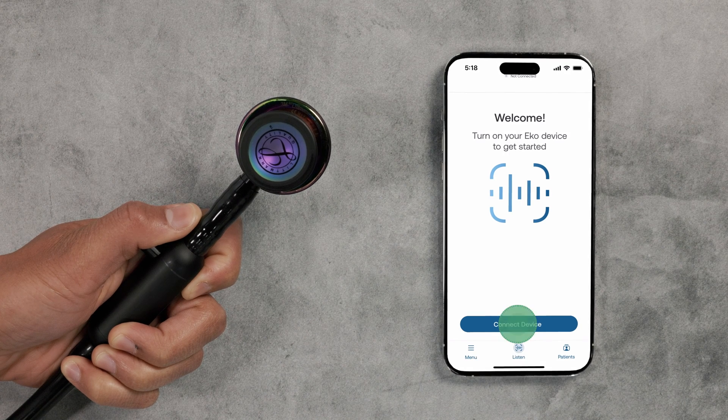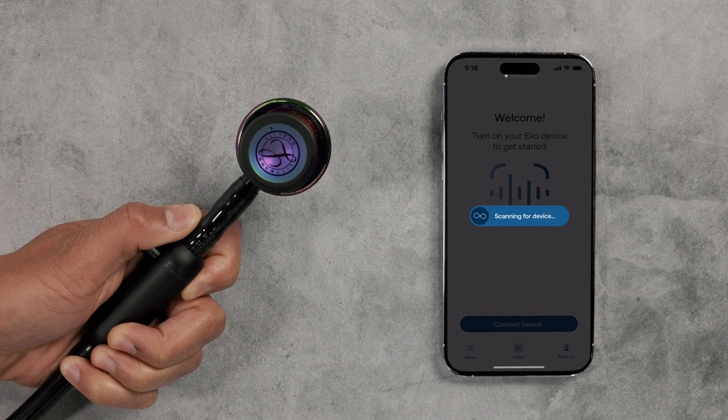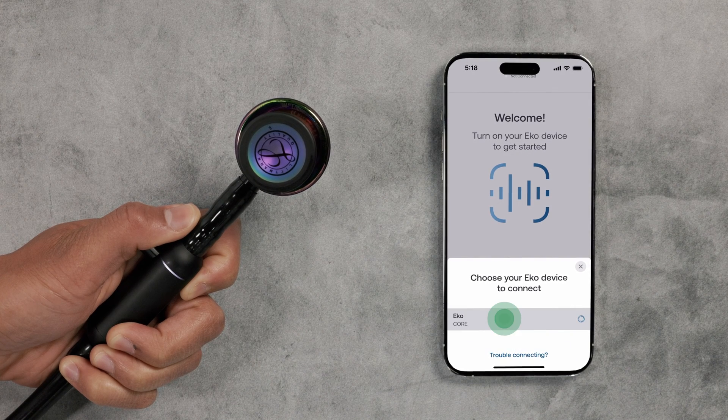Follow the on-screen instructions for connecting the Core. You'll need to connect your Core to the app using Bluetooth pairing.